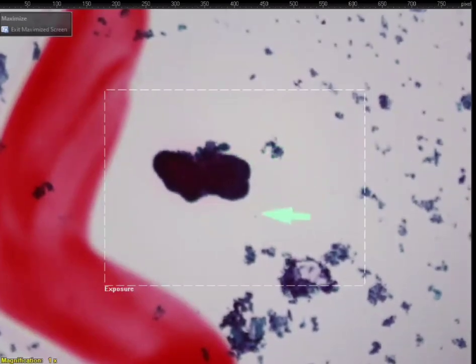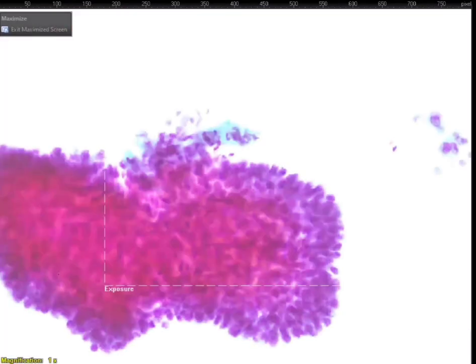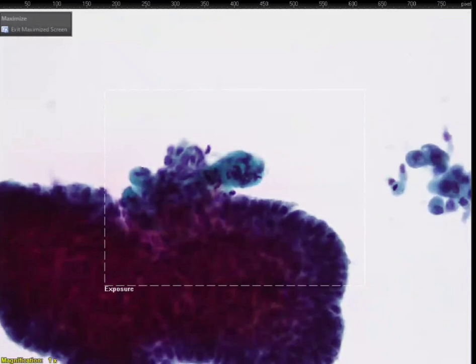And here, you remember how we said a nice smooth edge. Look at that smooth edge. This massive little papillae kind of thing. Do you see it almost looks like an extruding central core here? See the central core here, extruding out of this big chunk of papillary group.